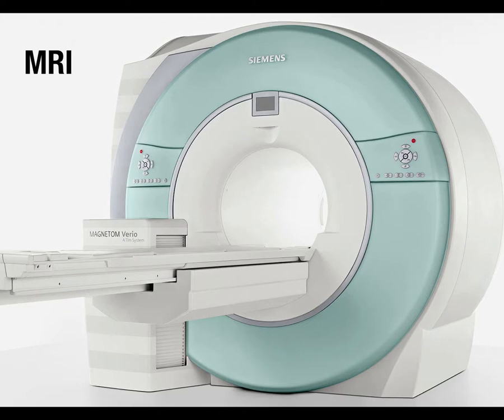Ultimately it gives you better signal to noise, or what we call contrast to noise, in the image. And both for functional imaging and for structural imaging, that improved contrast to noise buys you a number of things, including obviously better image quality, but that means you can push the spatial resolution higher. Typically, sometimes you can scan a little faster.